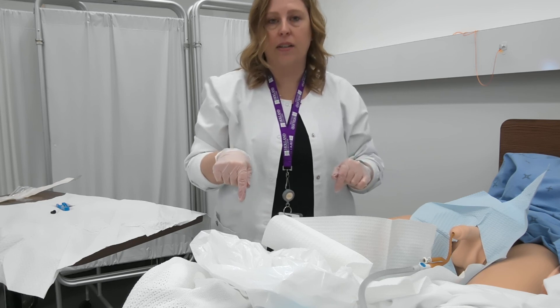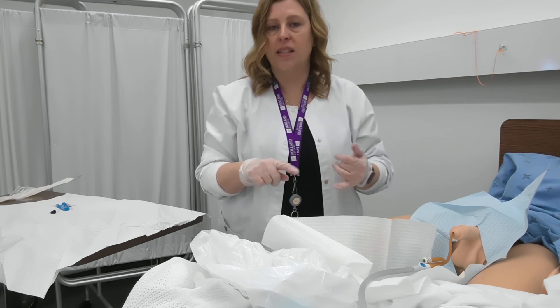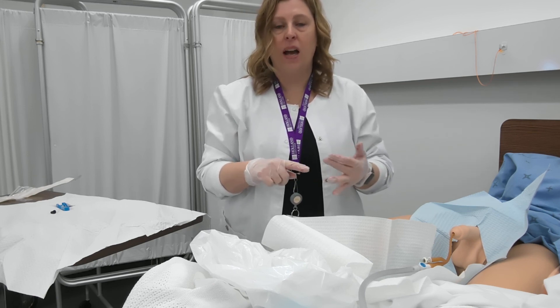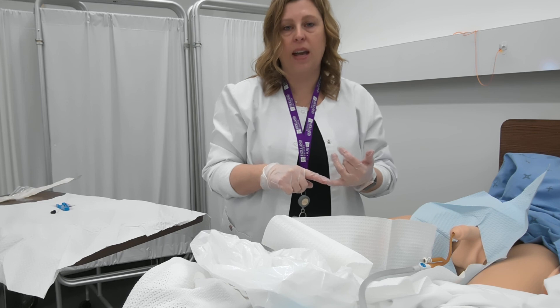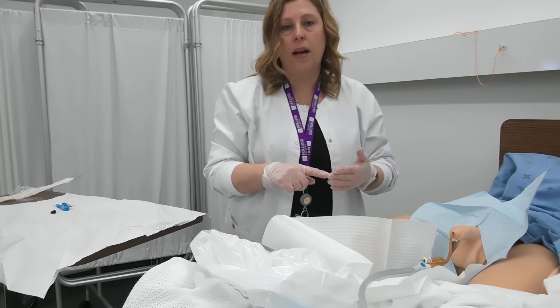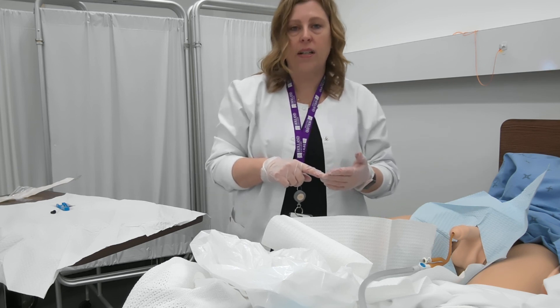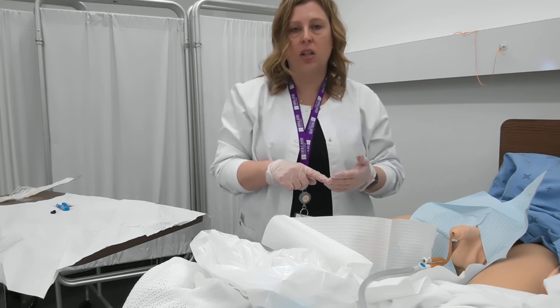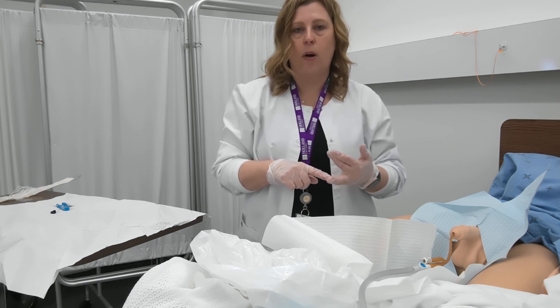I'm going to go ahead and document when I get back to the nursing station. I want to document the size of catheter I put in, how many cc's of fluid I used to inflate the balloon, the reason I put in the catheter, and the client's response. I'm also going to mention what the returns were like — the quantity of urine that came out and what it looked like. I'll also record my urine output on the intake and output form.